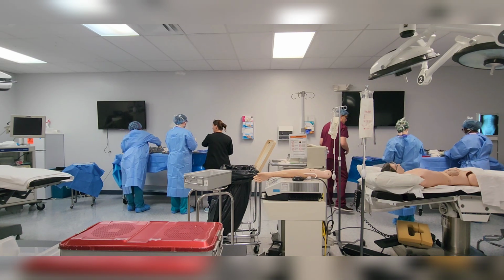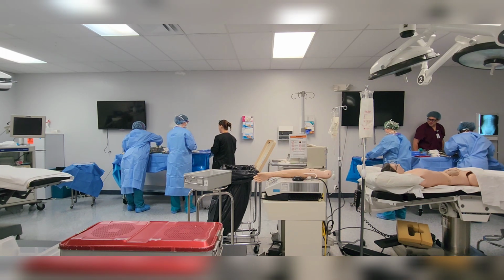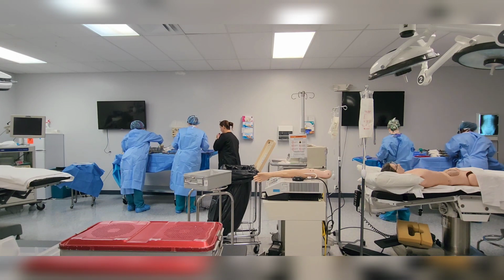Cokers. I want you guys to feel like this, that's how I do it, because the Kellys are the closest to you. You do what you're comfortable with. So when you're standing at the field, they should stay put, nice. Put some stuff on that Mayo.